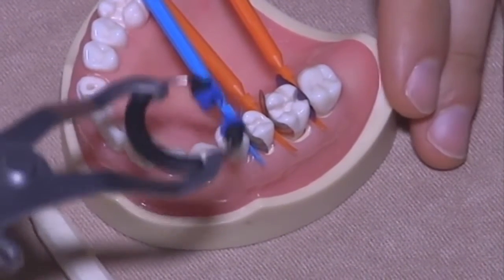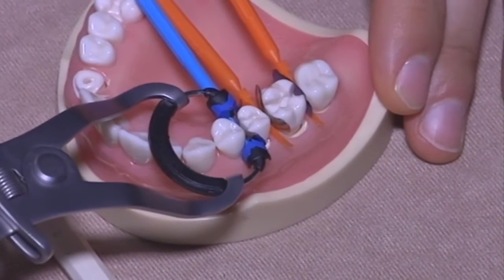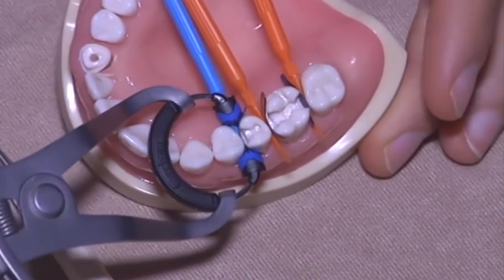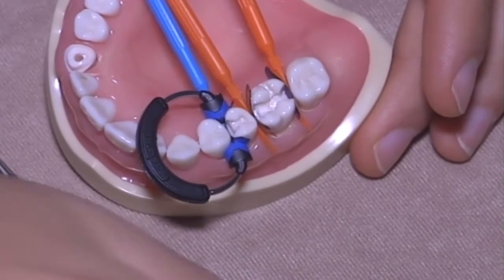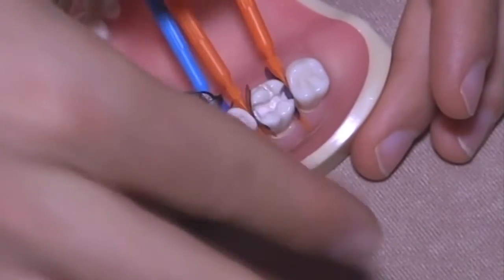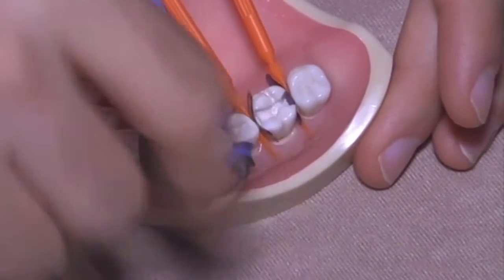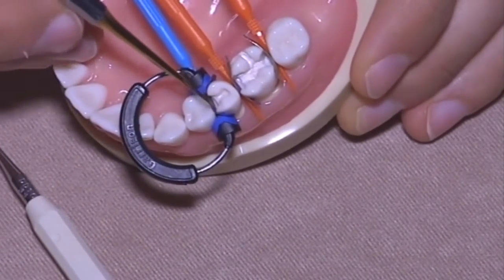The ring must be placed opening it as much as you can and then closing slowly in order to avoid that the matrix is pushed in between the interproximal area. If you do it immediately, the matrix is closed in between and you can have a problem here.